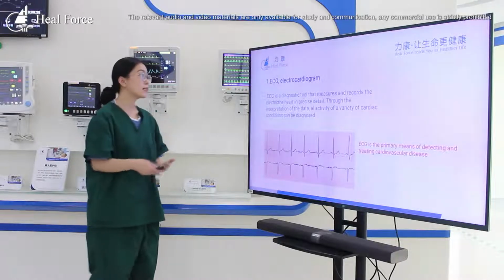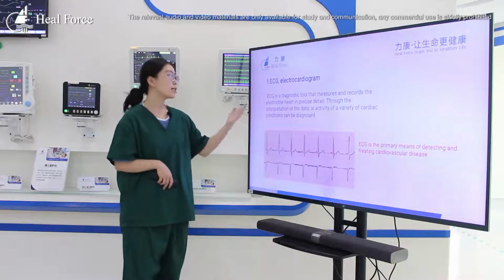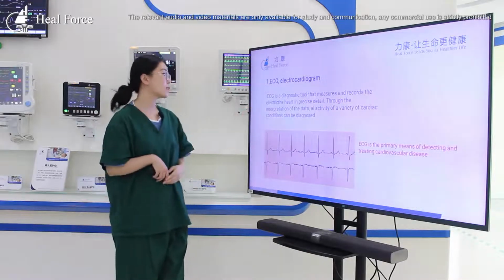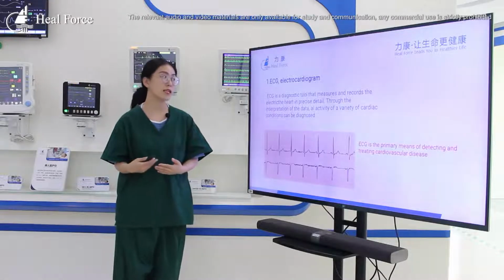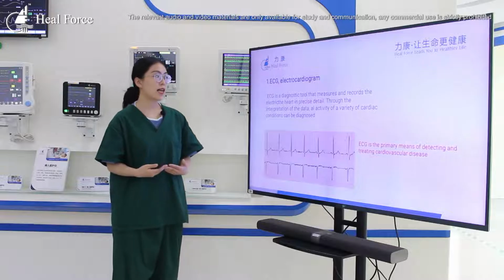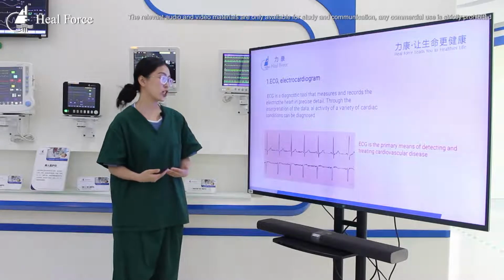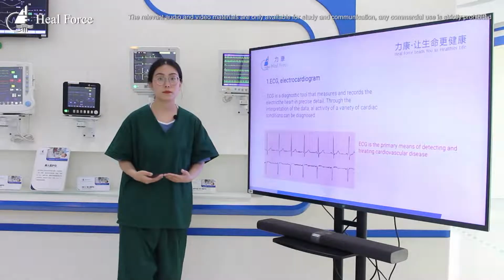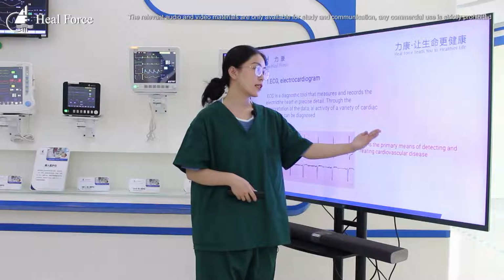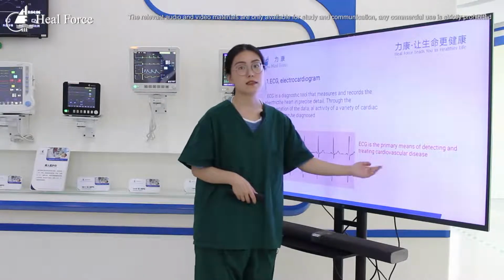So what is the ECG? Electrocardiogram. ECG is a diagnostic tool that measures and records the electrical activity of the heart in precise detail. Through the interpretation of the data, a variety of clinical conditions can be diagnosed. ECG is the primary means of detecting and treating cardiovascular disease.